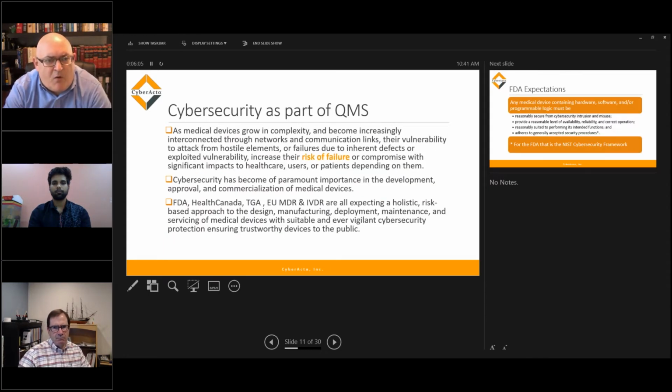And really, from an overall standpoint, their main concern is the risk of failure. It's what would happen if there's a vulnerability that may cause a device, either a diagnostic or a medical device or a companion diagnostic, whatever the case may be, anything that runs software, to fail. And as we go forward, cybersecurity has become of paramount importance in the development, approval, and commercialization of those devices. Some countries are more strict than others in terms of what they're expecting, but if I were to reduce it down, all of them expect a holistic, risk-based approach, end-to-end, from design, from manufacturing, from deployment, maintaining, and servicing of those medical devices.